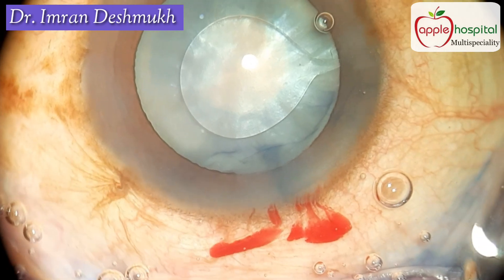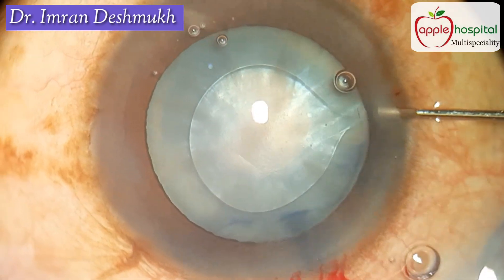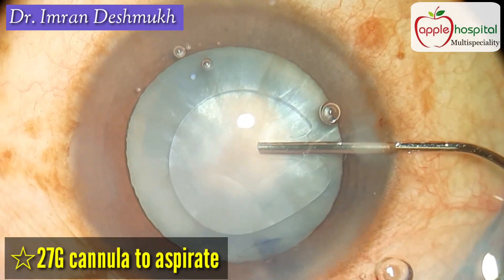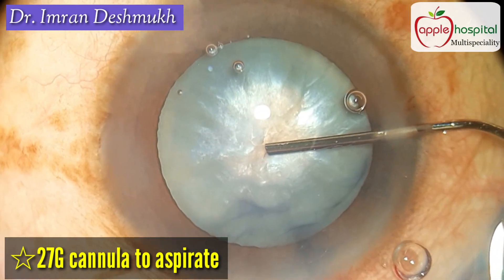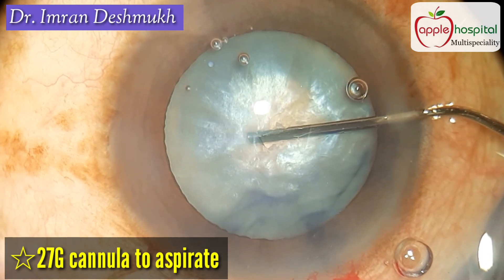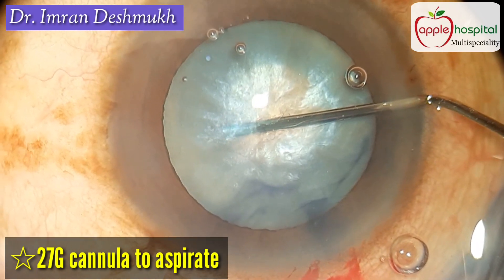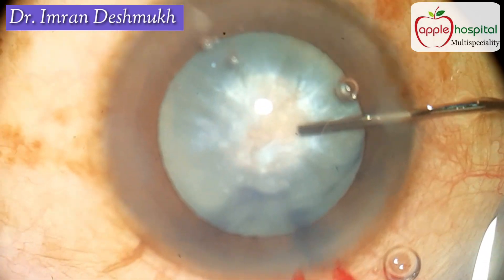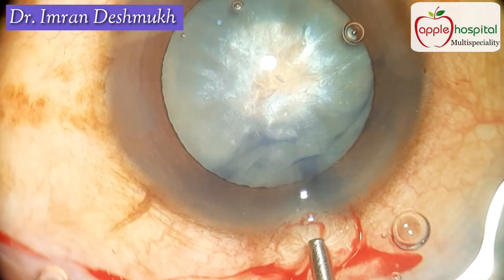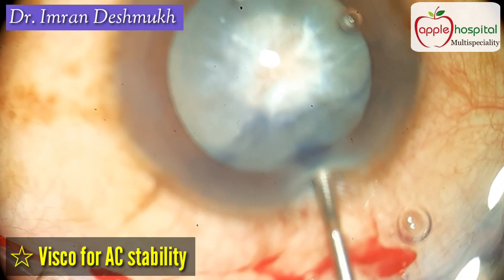Now bring in your 27-gauge blunt cannula and aspirate as much fluid as you can. Sometimes I even go inside the bag to aspirate a lot of fluid. You have to be steady and slow during this step.